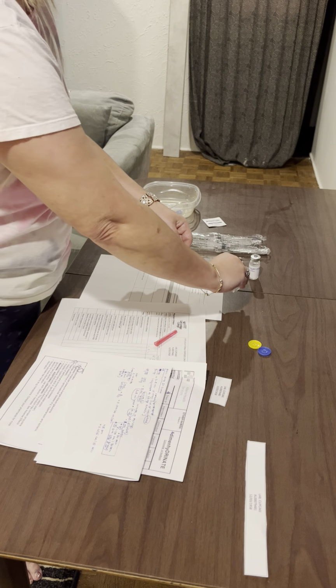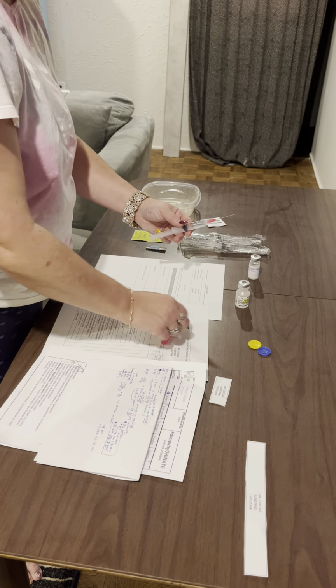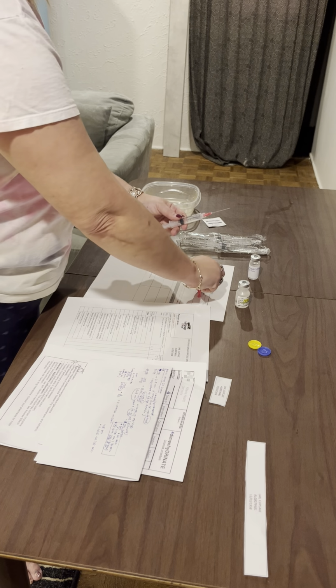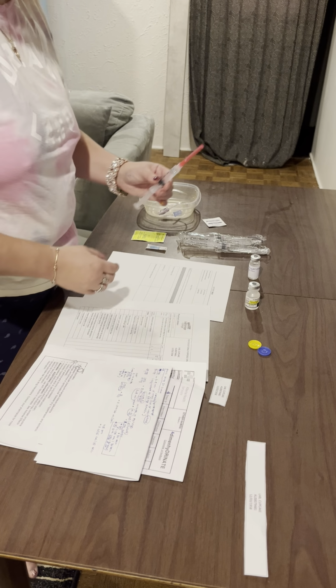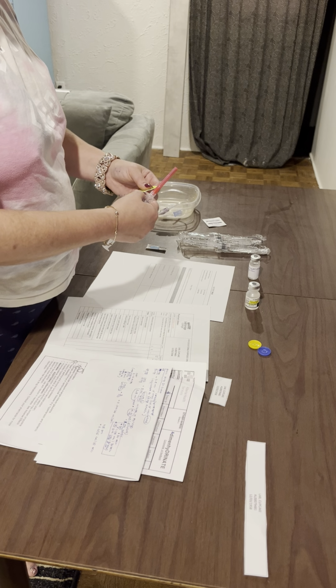So we're going to pull this out. And we're going to recap this. And again, we would do the bubble thing before and after. And we are now going to put our sticker on.